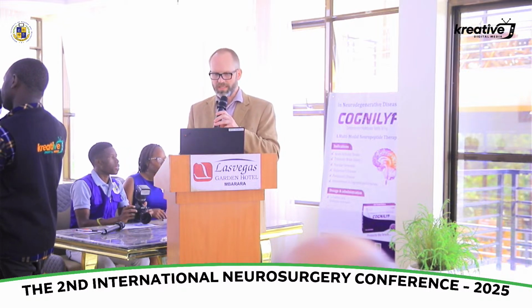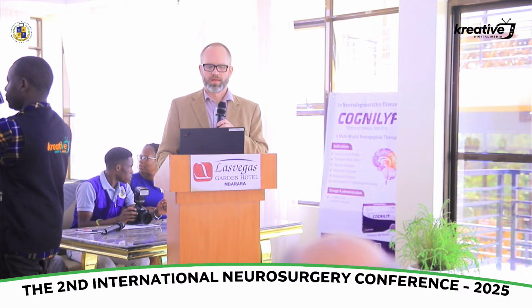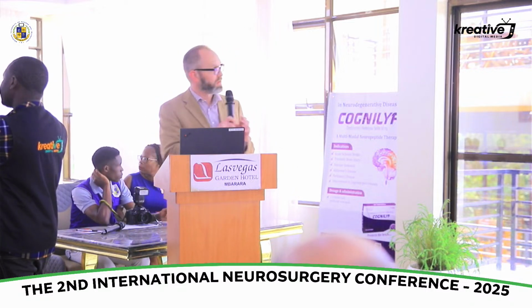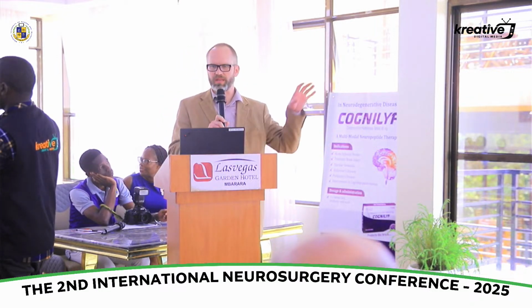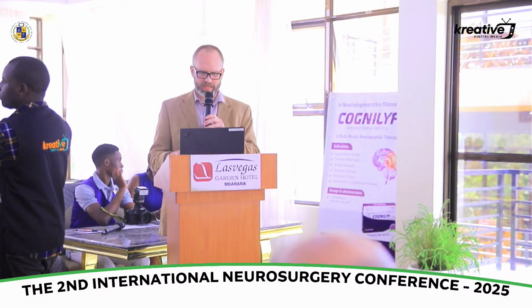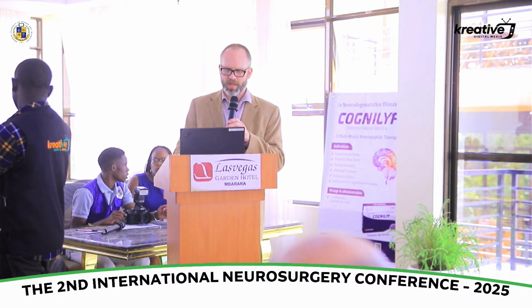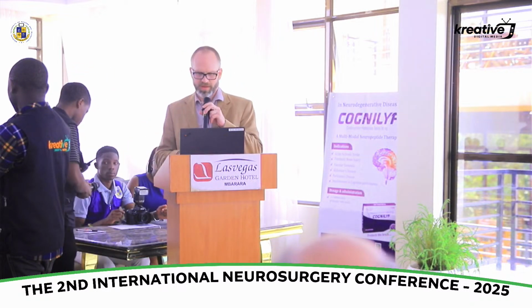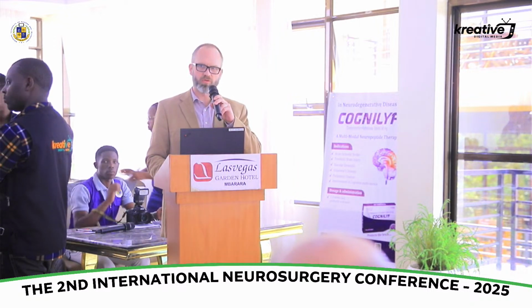But what you can see here is normal brain tissue. As you get, so A is normal and B is tumor tissue, and you see that the tumor tissue being much more dense, you have much higher amplitude and clearly distinguishable, demonstrated on the left in panel A. So that was the first demonstration in humans of the potential for ultrasound in neurosurgery.